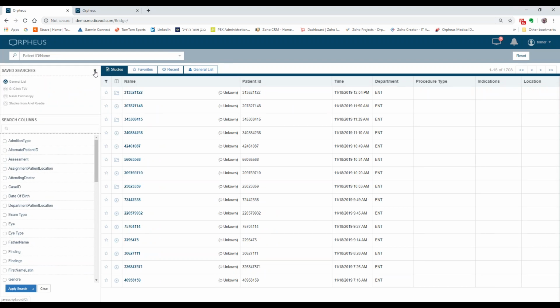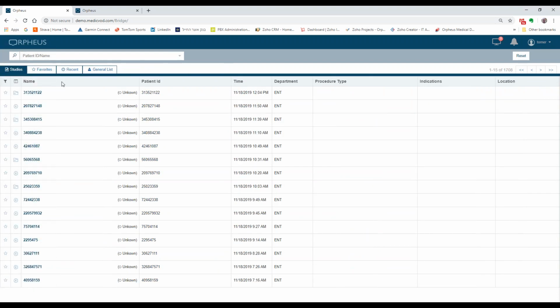I think we can pause and stop here because we're close to time and leave that for the more advanced training and capabilities of the system. And you answered the questions that I had on my PDF for my tip sheet, so this just reinforced that info.